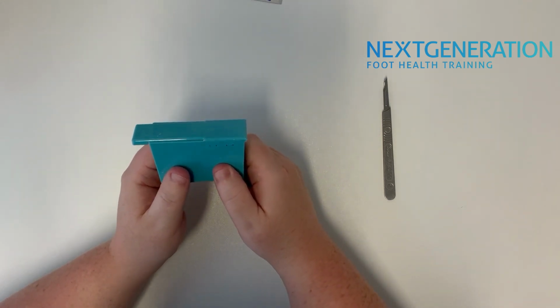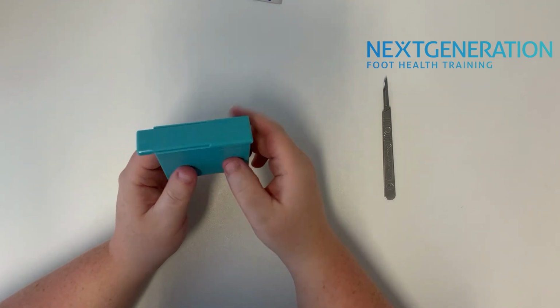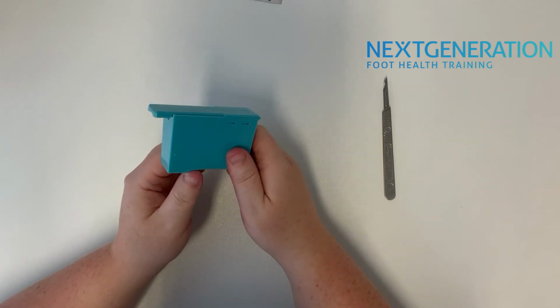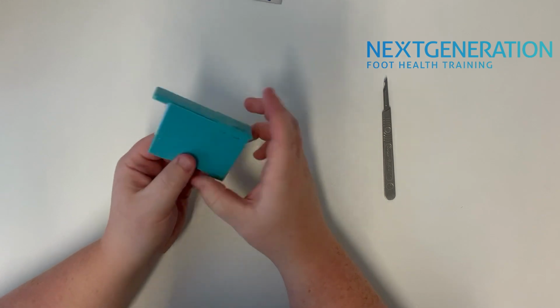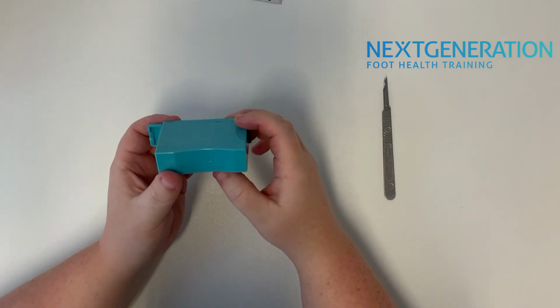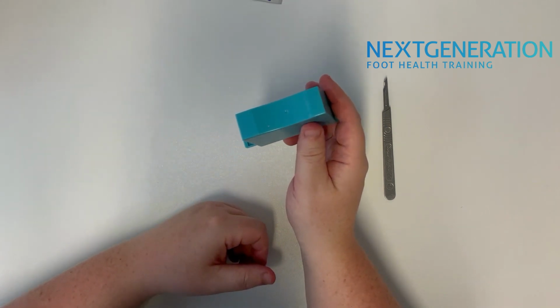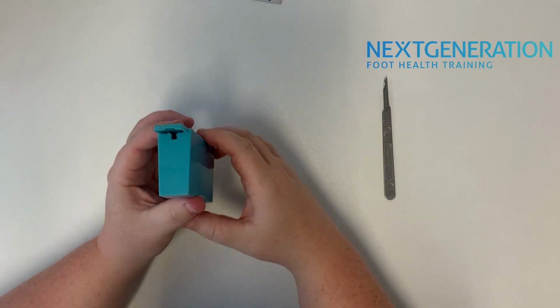You need to be really getting a big clinical waste bin to be able to put it in, and then getting a collection for that, of course. These are really cheap, so if at any point it wears or it starts playing up or anything like that, for a couple of pounds, just get yourself a new box. But you also have to be careful with them as well, because if I shake it like that, you can see some of the old blades coming out, so you need to be very careful with them as well.